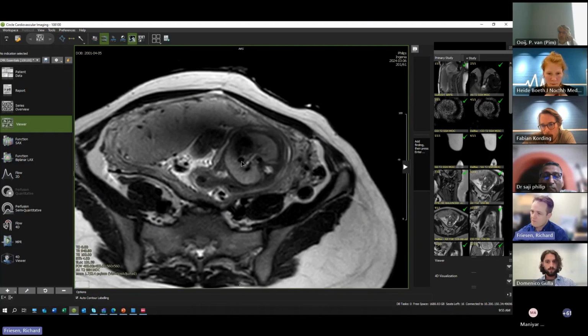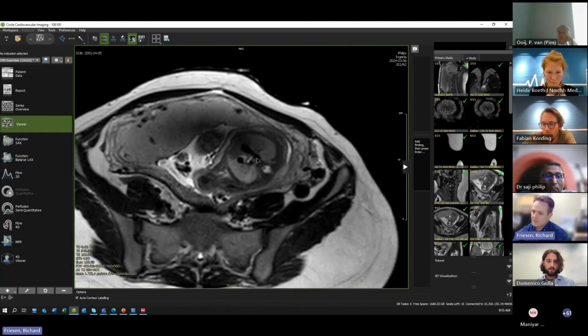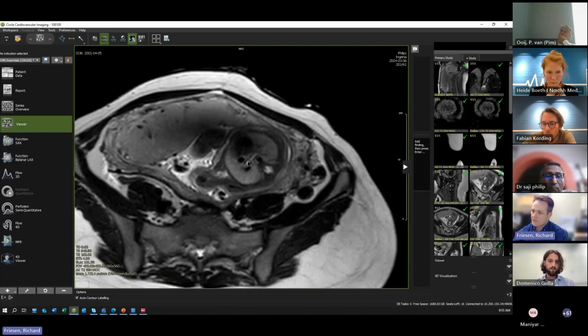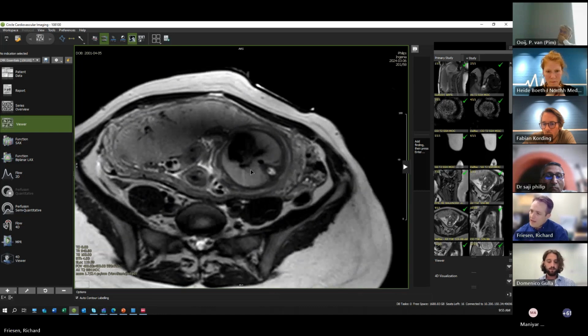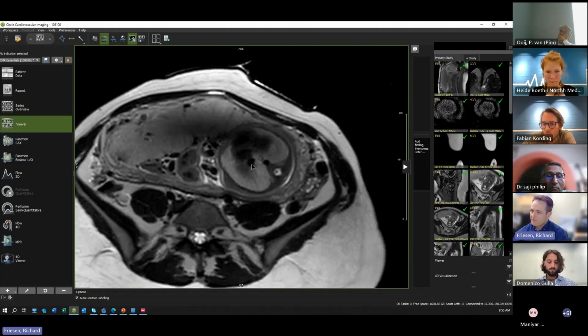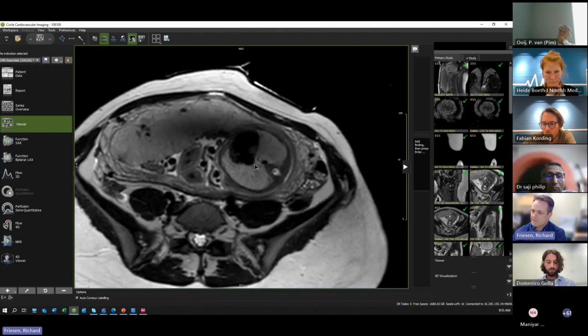We see the right SVC, the cardiac mass, a large ductus arteriosus. These bright images of the airway branching off into the right and left bronchi. And then we see our inferior vena cava inserting in, our descending aorta over on the left side.